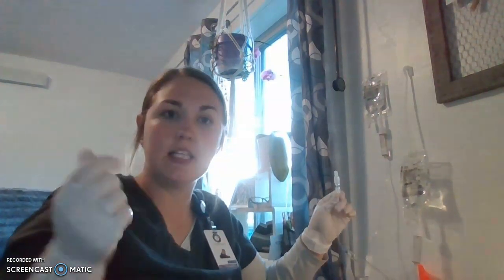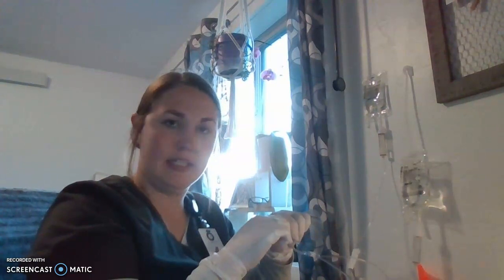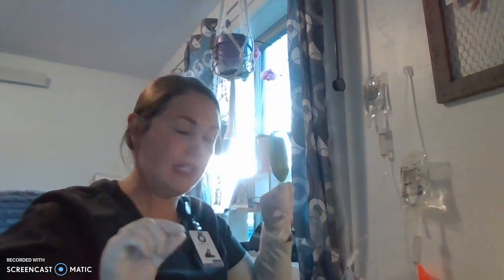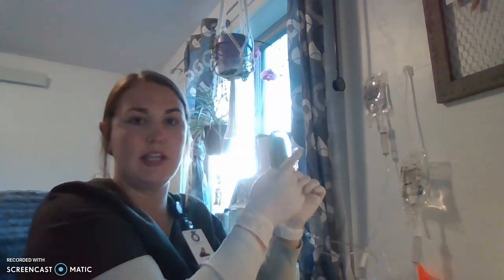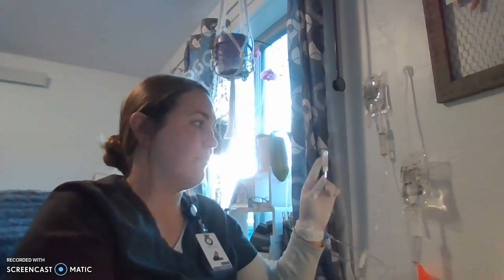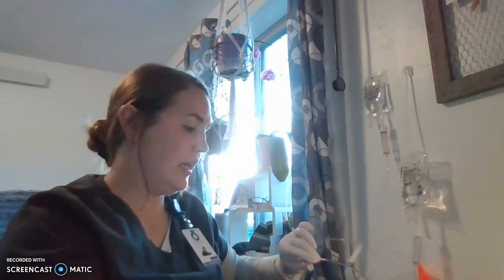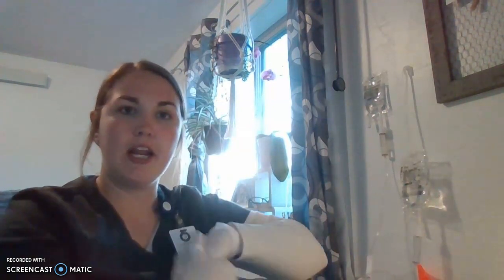We would then clean the patient's IV connector access with an alcohol swab for 15 seconds, let it air dry, and connect this while maintaining sterility with the adapter end — after we've verified allergies, verified the MAR, and verified our six rights of medication administration. Once we've got this running, we can wash our hands, dispose of our gloves, and document that the medication has been given.